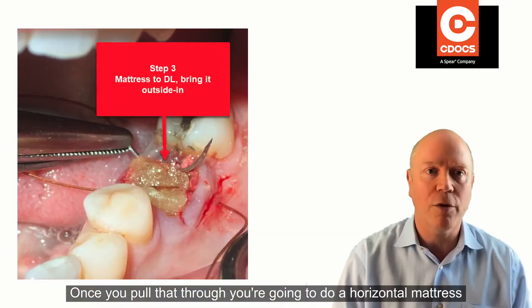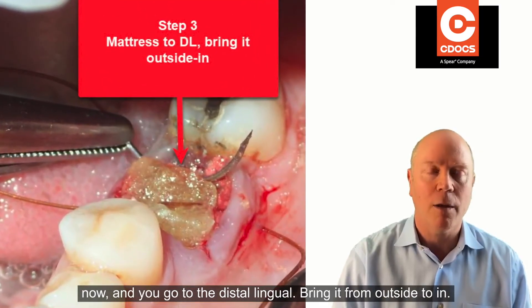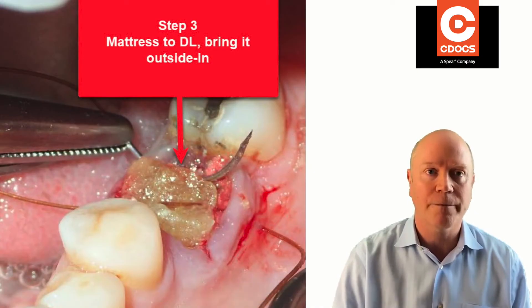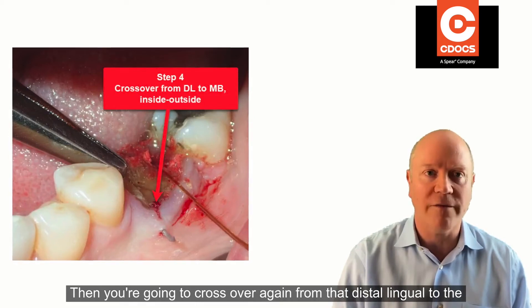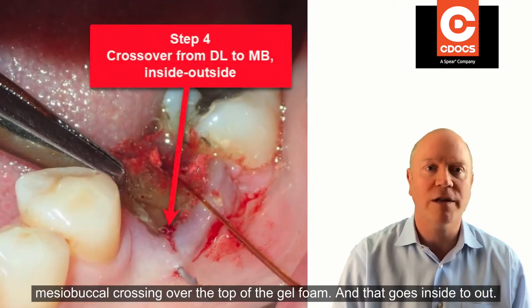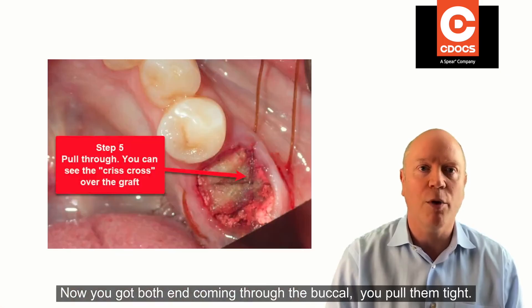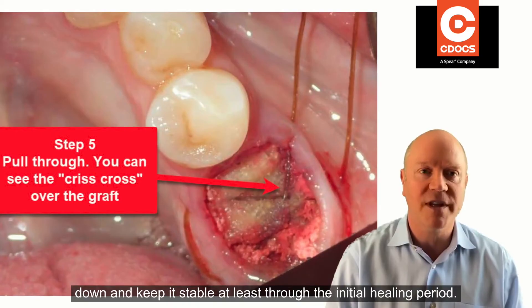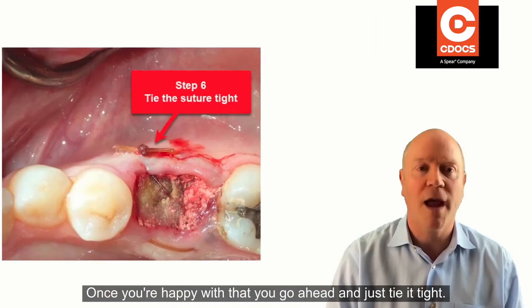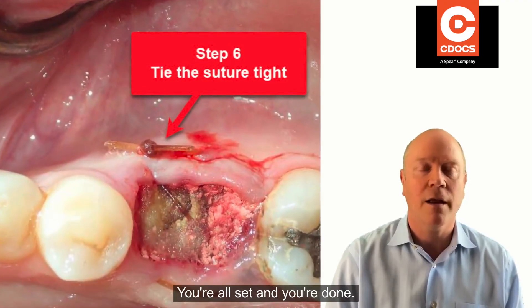Once you pull that through, you're going to do a horizontal mattress. Go to the distal lingual, bring it from outside to in, and then cross over again from that distal lingual to the mesial buccal — crossing over the top of the gel foam — and that goes inside to out. Now you've got both ends coming through the buccal. Pull them tight, you'll see the crossover on top — that's going to hold everything down and keep it stable through the initial healing period. Once you're happy with that, tie it tight and you're done.